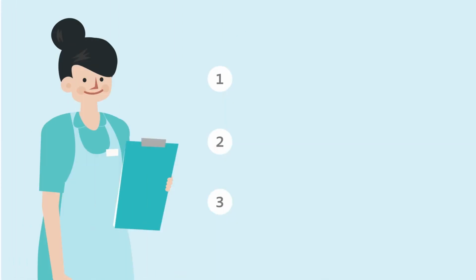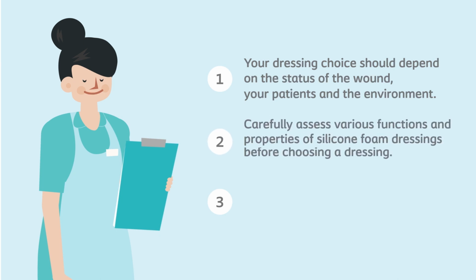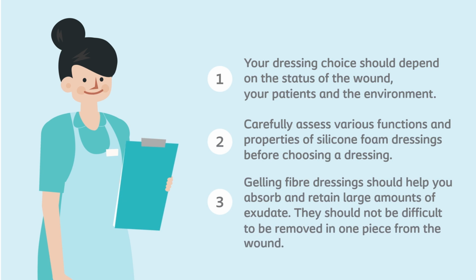To wrap up: 1. Your dressing choice should depend on the status of the wound, your patients, and the environment. 2. Carefully assess various functions and properties of silicone foam dressings before choosing a dressing. 3. Gelling fiber dressings should help you absorb and retain large amounts of exudate. They should not be difficult to remove in one piece from the wound.